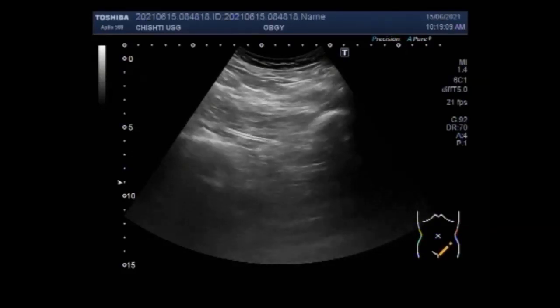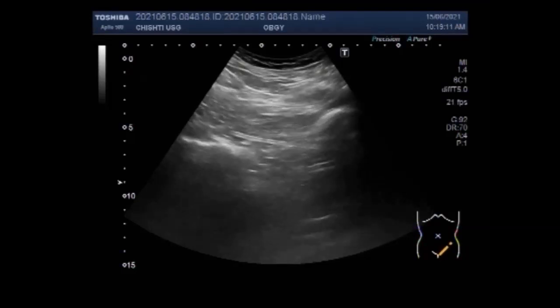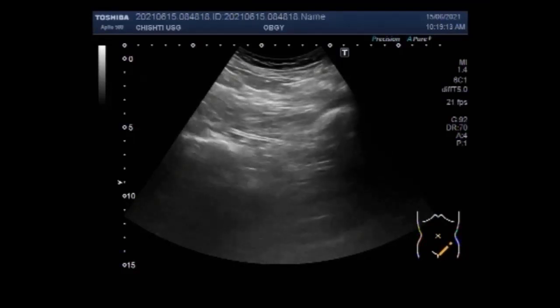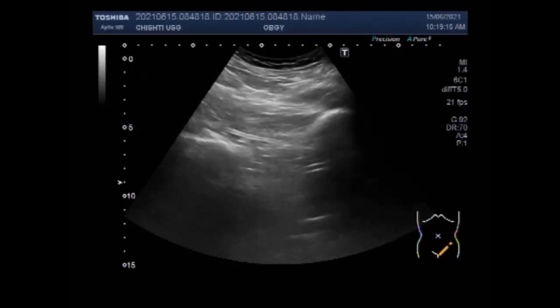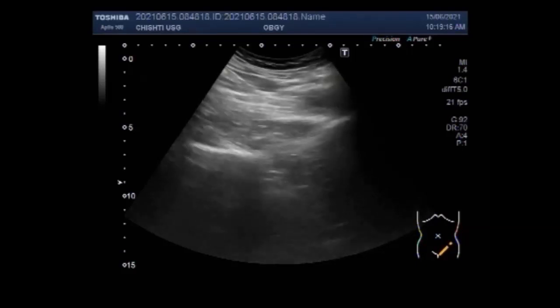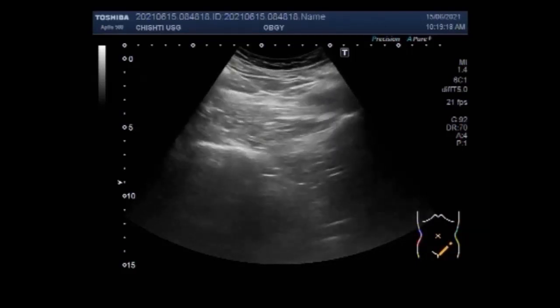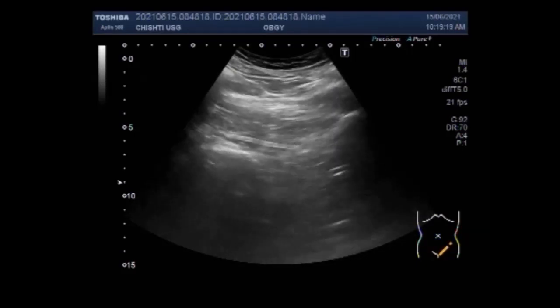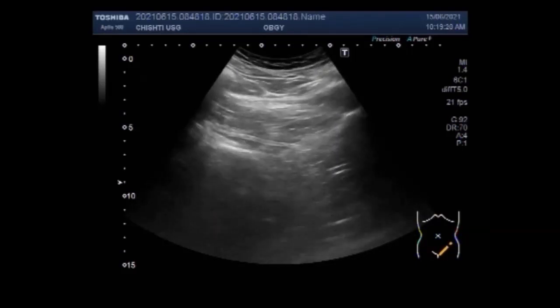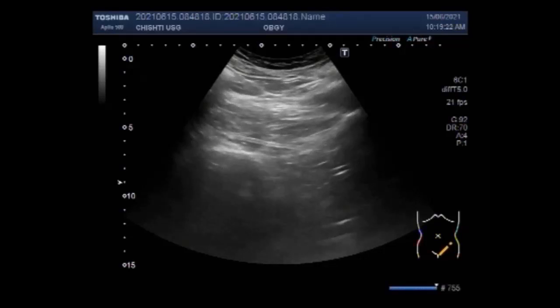Ultrasound offers a rapid, safe, and non-invasive approach to the diagnosis of intestinal ascariasis. Ultrasound is also the modality of choice for diagnosis of hepatobiliary ascariasis, which is relatively rare and is due to migration of intestinal worms through the papilla of Vater.